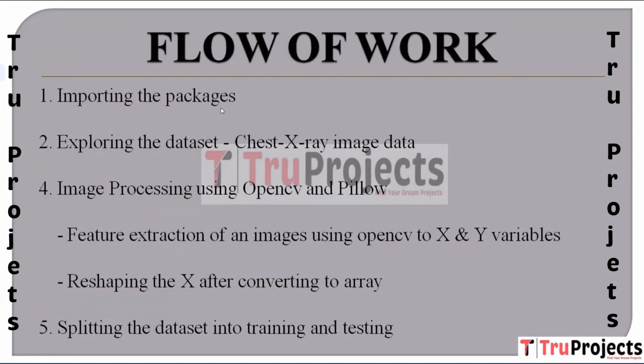Exploring the dataset, chest X-ray image data. So in this, understand the dataset structure, contents and characteristics. This often includes examining the types of data available, checking for missing values and gaining insights into the distribution of classes in the case of a classification problem.